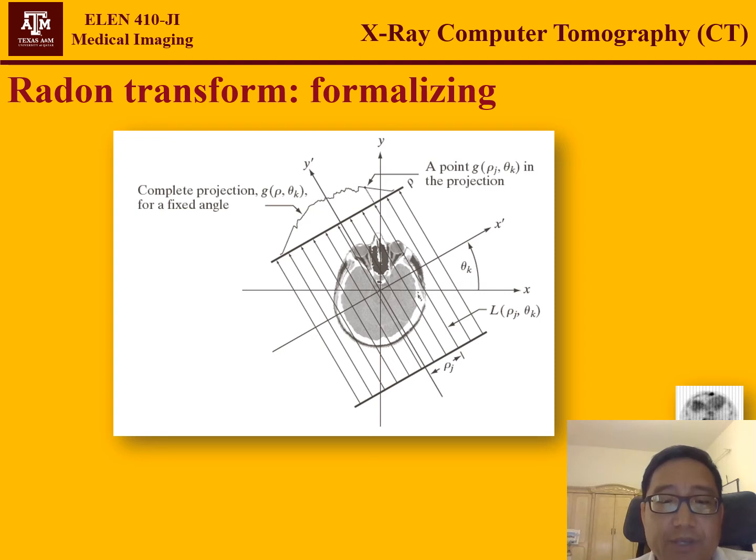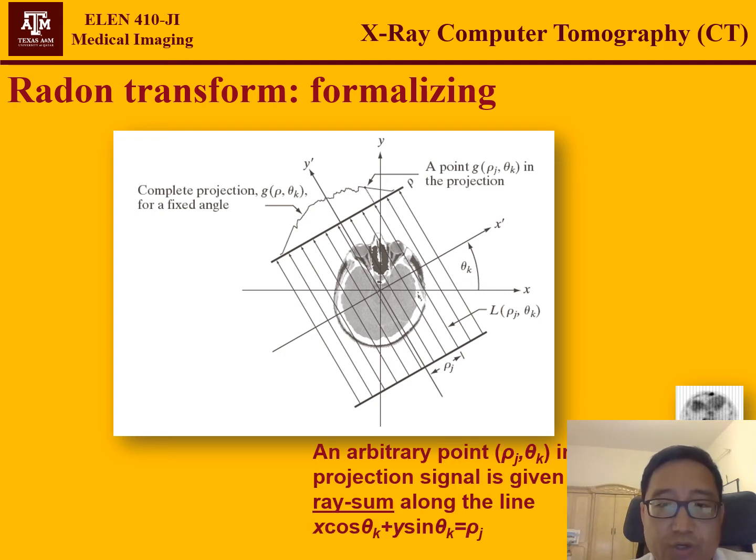Then the total attenuation you accumulated along on the other side, you shine this ray at any particular location. In the real application, of course, your detector has a finite element, so you only have discrete locations, and the angles, you also just take a finite number of angles, so there's a J and K, just indicate those detectors and angles.